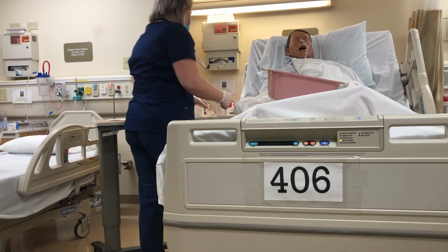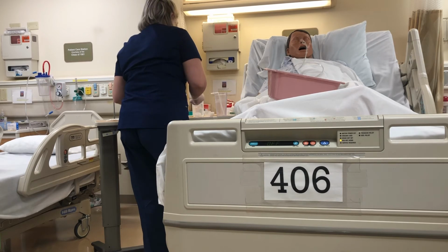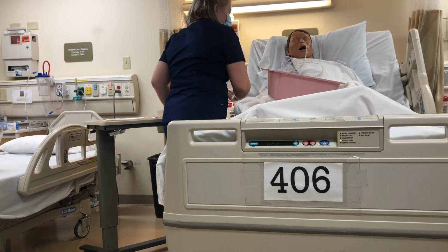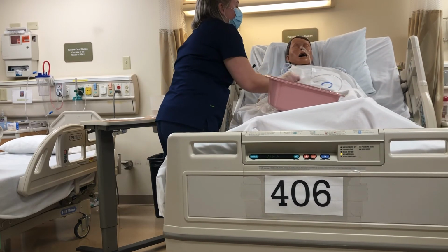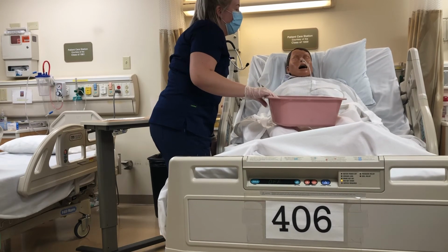Alright, and that test strip looks like it's acidic. It's coming about a 3, so I think that helps solidify our placement. Now I'm going to set you up to suction. Are you still doing okay? Are you finished with this emesis basin? Do you think you'll need it? No? Okay.